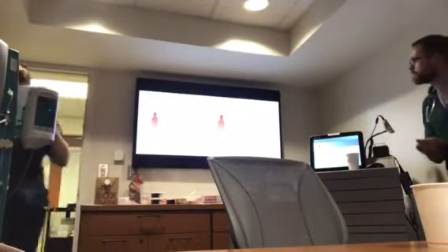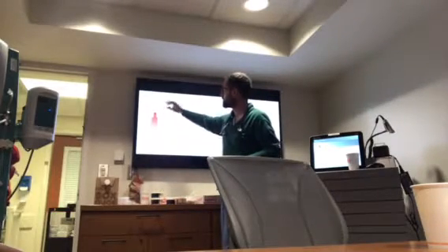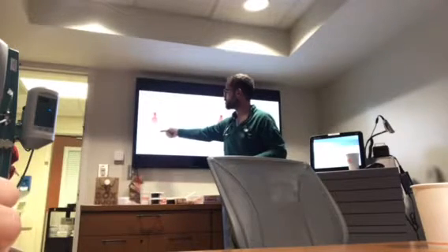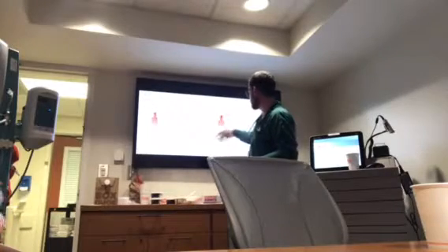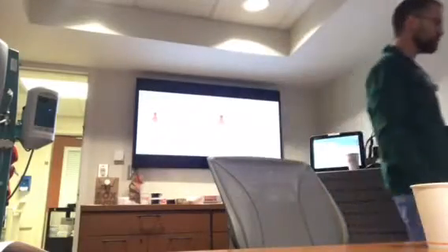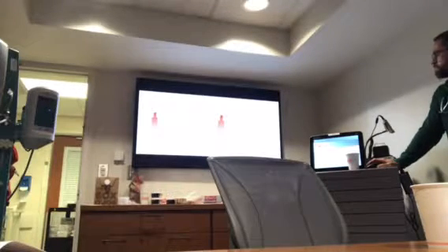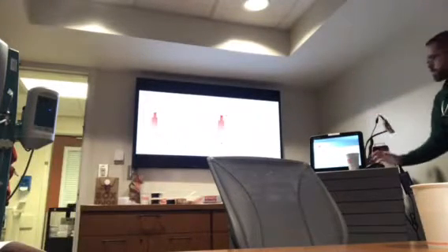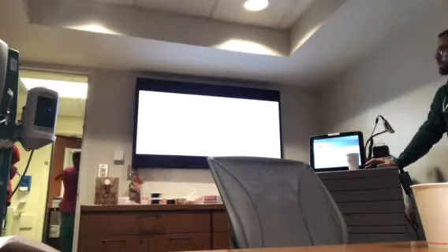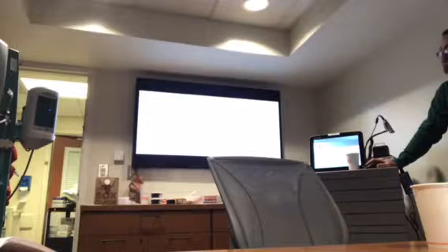And you can see here, blood entering at the top and the flow of dialysate entering at the top. You get a down regulation in the amount of particle solute movement as you go lower in the filter. And then in countercurrent, where the blood and dialysate flow in opposite directions, you get this maintained concentration gradient throughout the entire filter, okay? Better clearance.